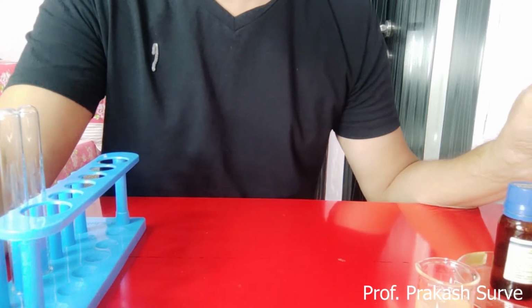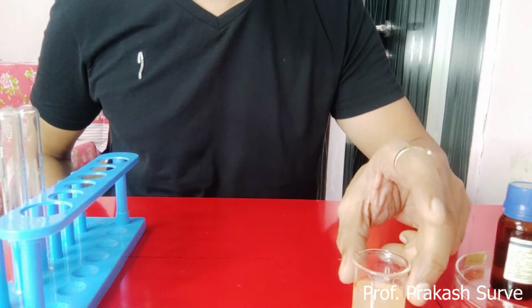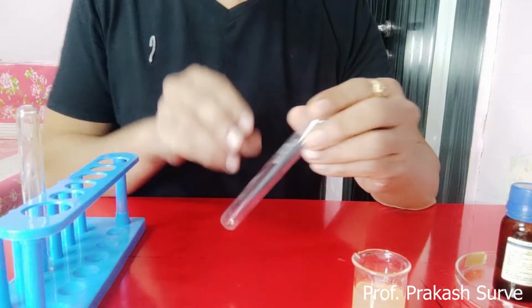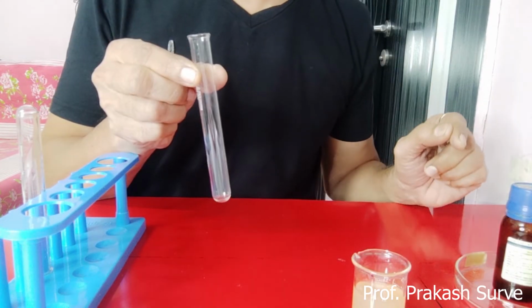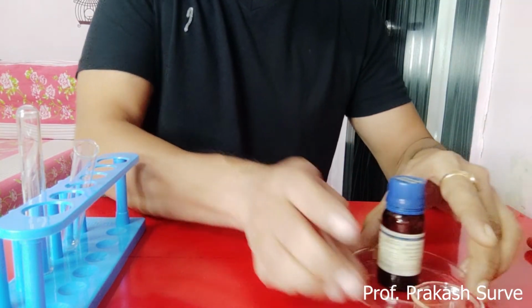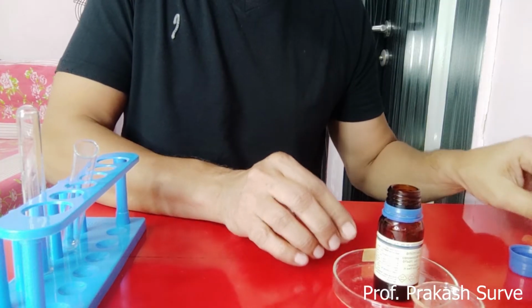Now we'll perform the test. For the test, as I said, we require the urine sample, the concentrated nitric acid, and the test tube. First we'll take approximately one-fourth of the test tube of nitric acid. It is concentrated nitric acid, so you have to be careful while handling it.